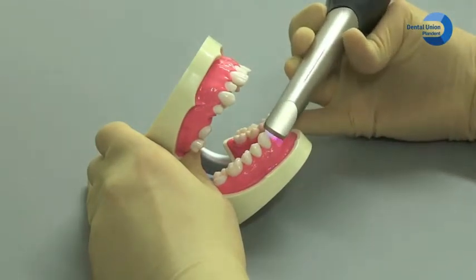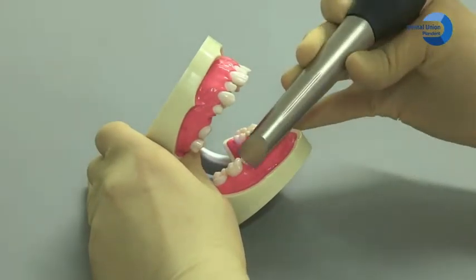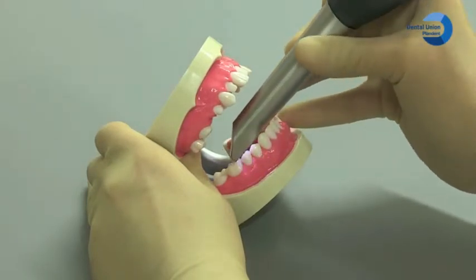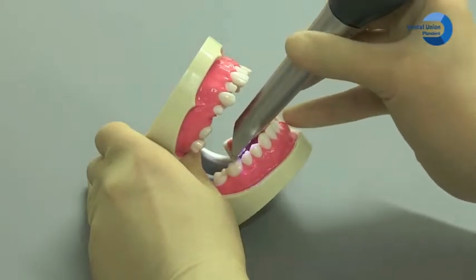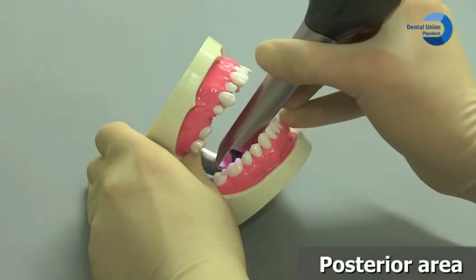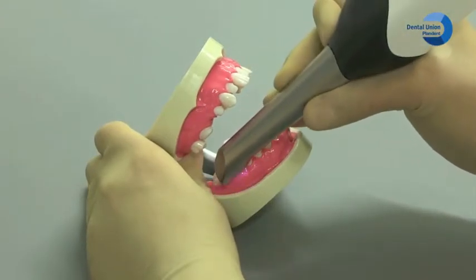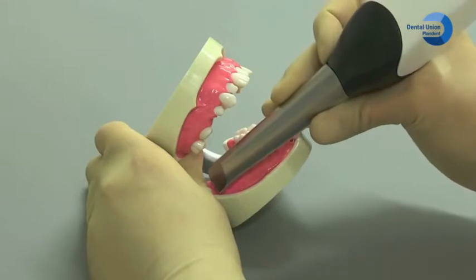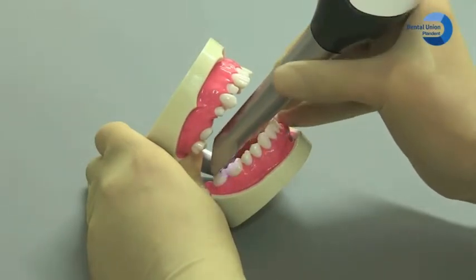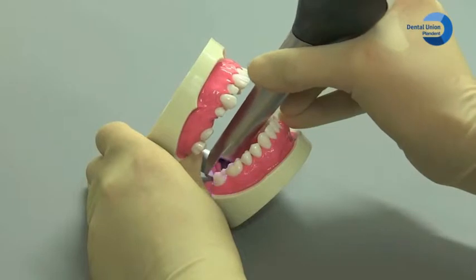Now guide the camera labially in the mesial direction and back again in order to complete the labial acquisition of the front teeth. For scanning the premolar and molar regions, now again guide the camera in occlusal, buccal, and lingual view.